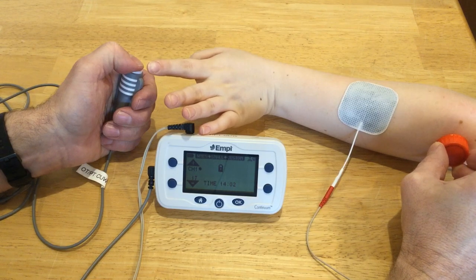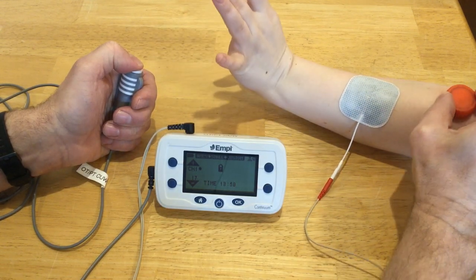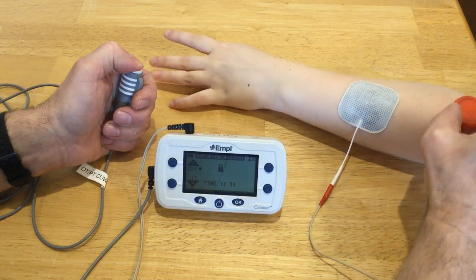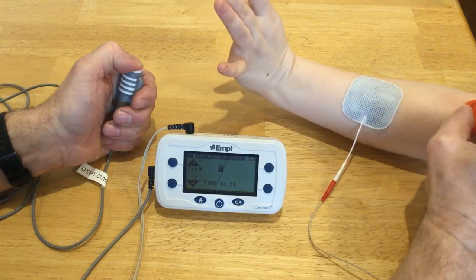If I go way back here I get wrist ulnar deviation and extension. So you can use this to find where that perfect spot is to put your electrode to get the response that you want.